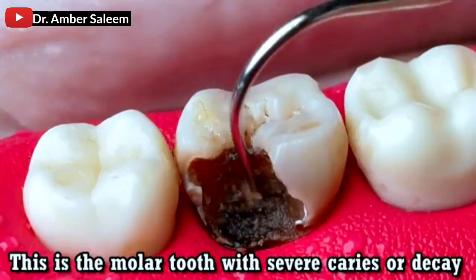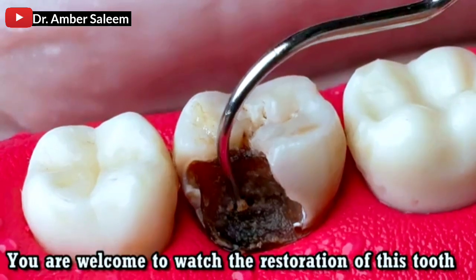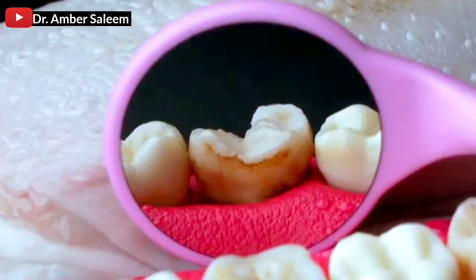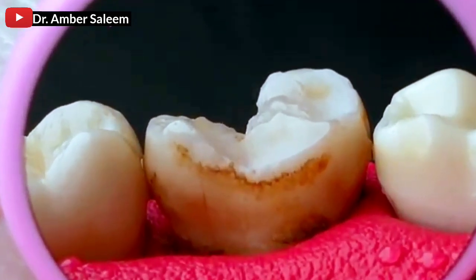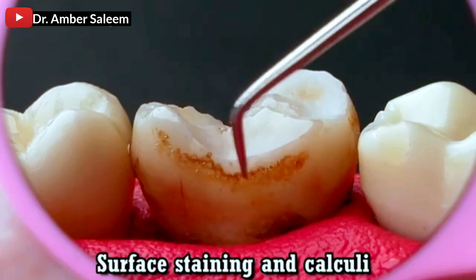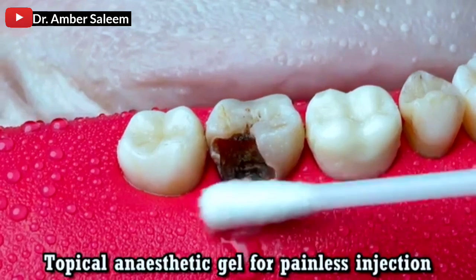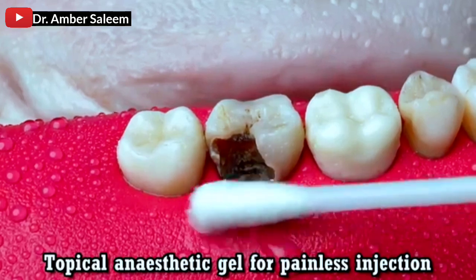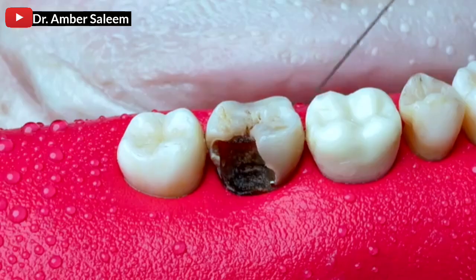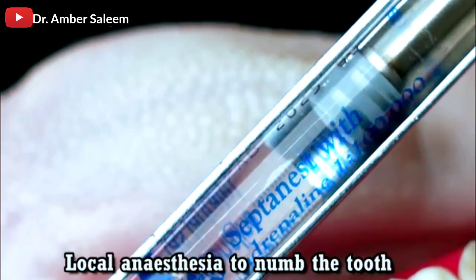This is the molar tooth with severe caries and decay. You are welcome to watch the restoration of this tooth. We begin by applying topical anesthetic gel for painless injection, followed by local anesthesia to numb the tooth.